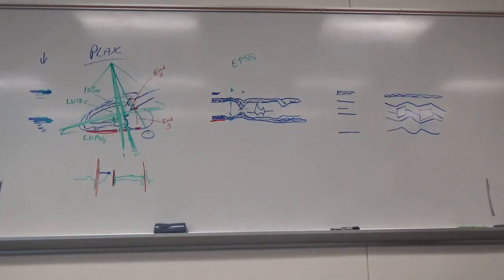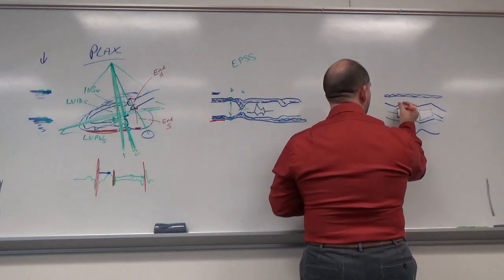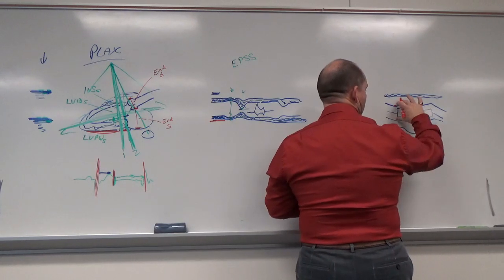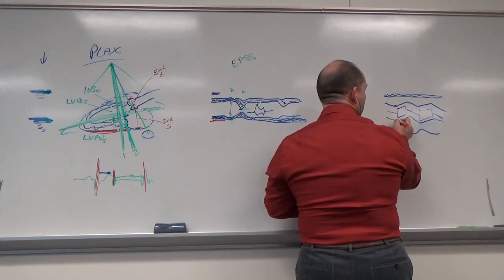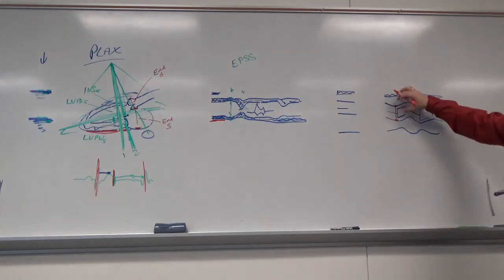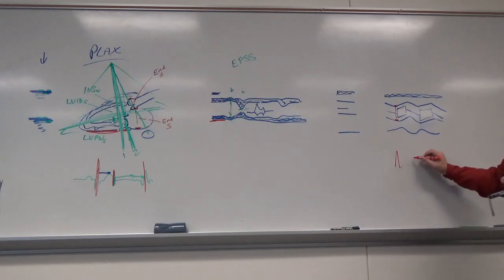Okay, same measurements we're doing in M mode. We're going to do exactly the same thing. So these are going to look like this. We're going to do leading edge to leading edge. So aortic root is this. You're going to do it in the biggest dip. Where this aortic root takes the biggest dip, which is going to correspond to my R wave.